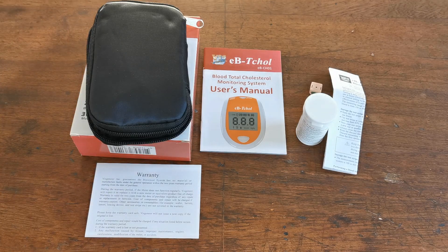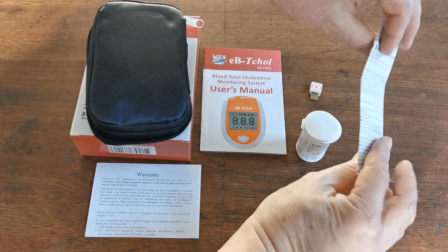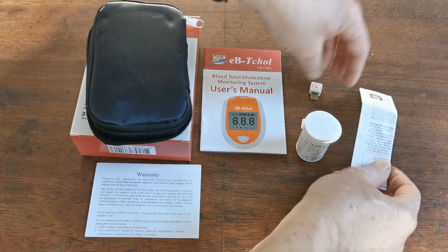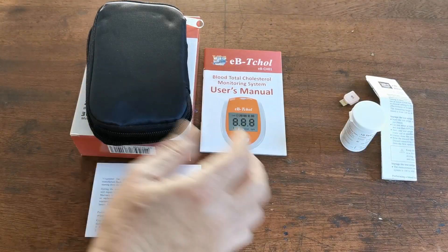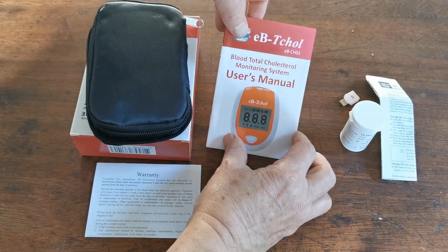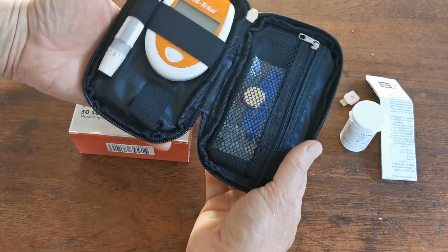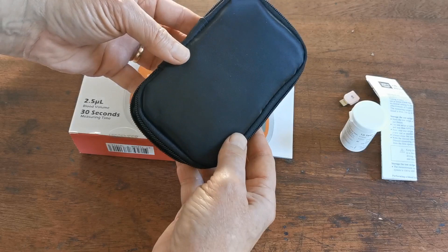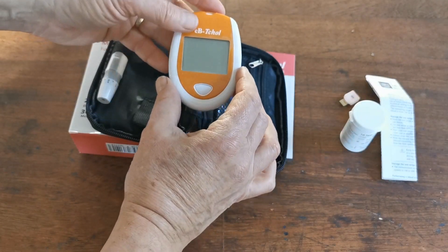Here are the contents of the box packs that we've unboxed. You've got 10 cholesterol test strips with an IFU — an Instruction for Users — and a code test chip. That's the 10 test strips. In the cholesterol starter meter pack, you get the user's manual, some warranty information from Visangir, and this is the actual meter pack.